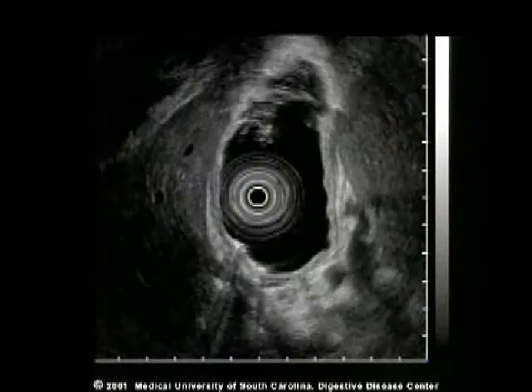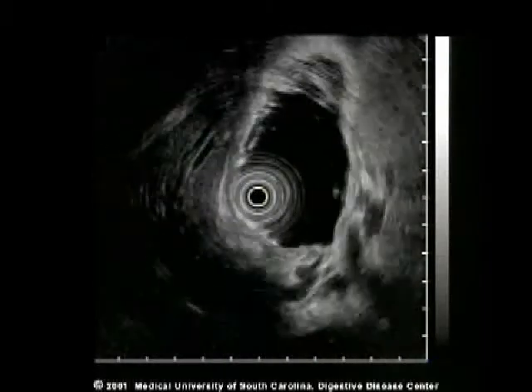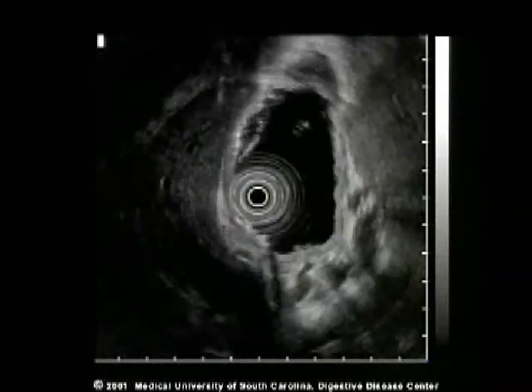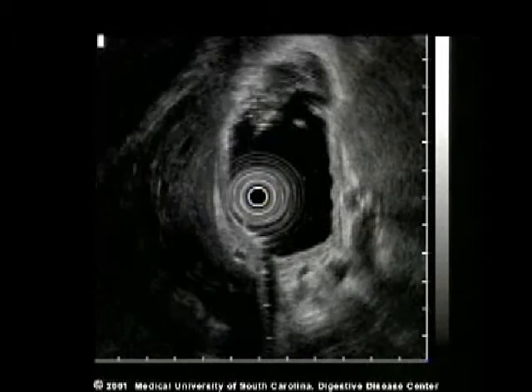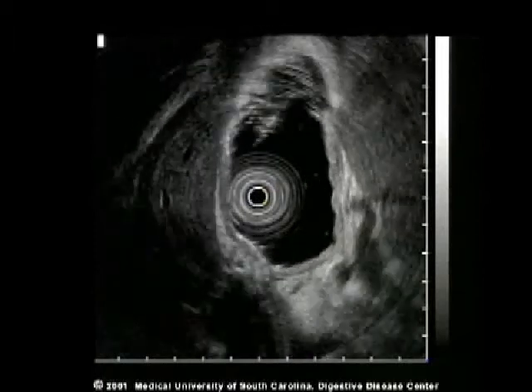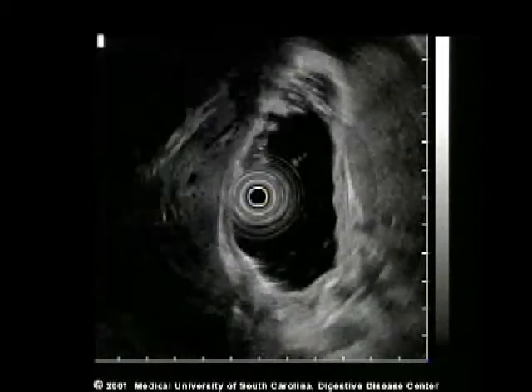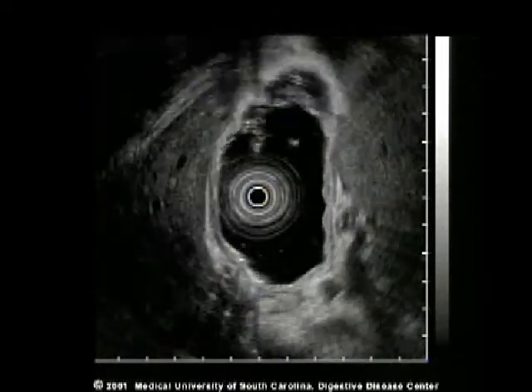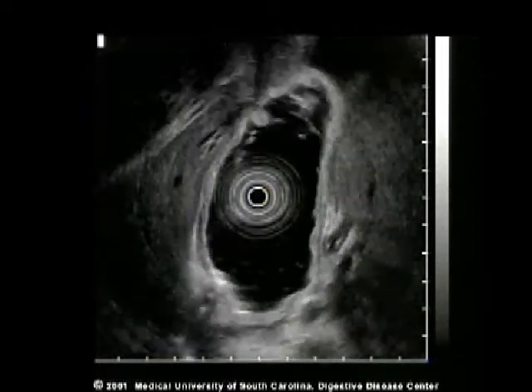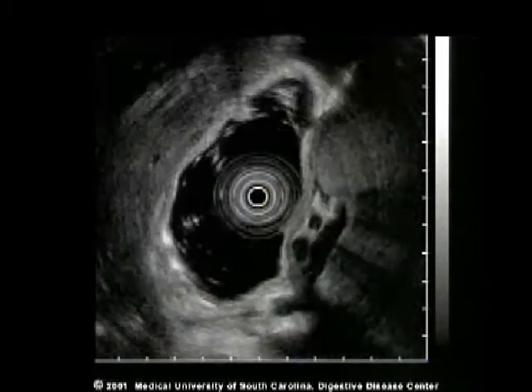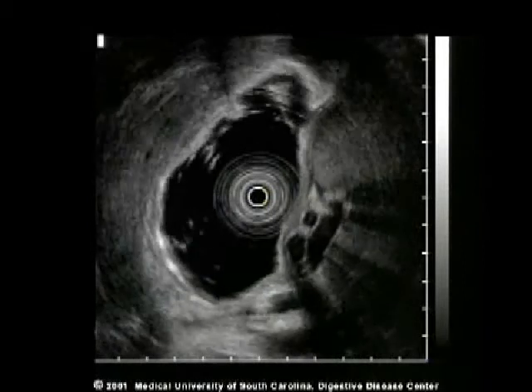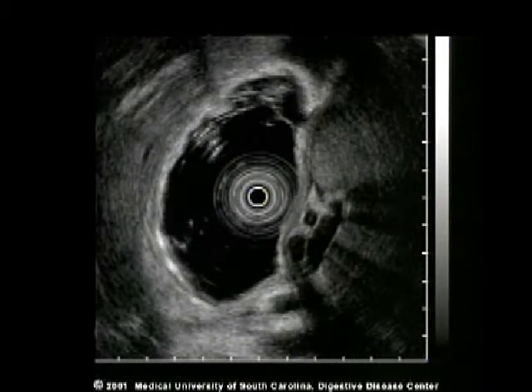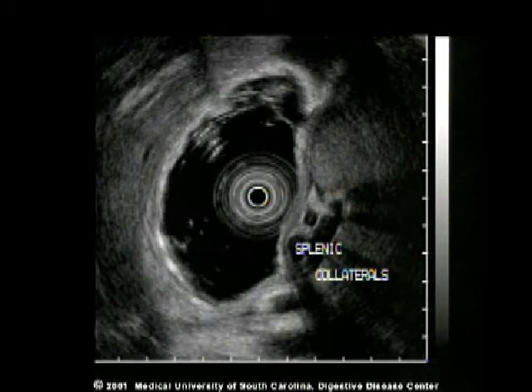Splenic and portal collateral vessels are also easily identified posterior to the stomach. In this case, on the bottom half of the screen, multiple tortuous vessels are seen arising near the splenic hilum and extending across the bottom half of the screen.